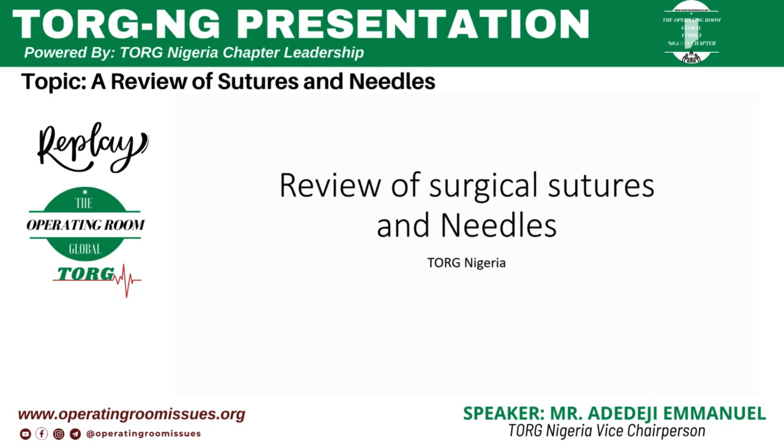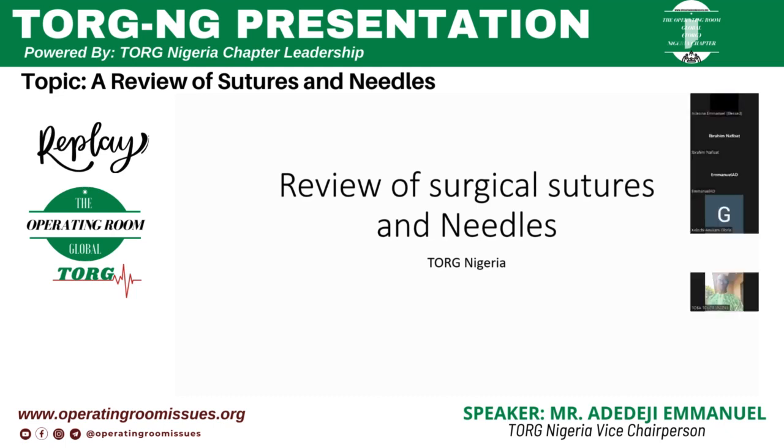Sometimes, I've mentioned NG tubes, drains at any site in the body, and most importantly, we use sutures to close up surgical incisions. The use of sutures has dated back hundreds of years, as old as medicine itself, since medicine started in the 19th century.